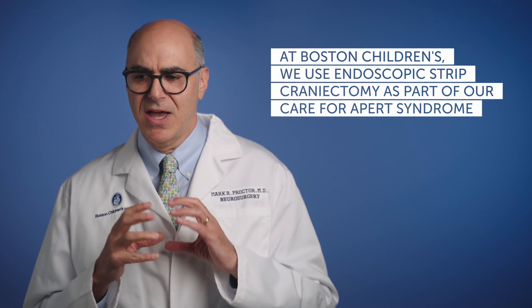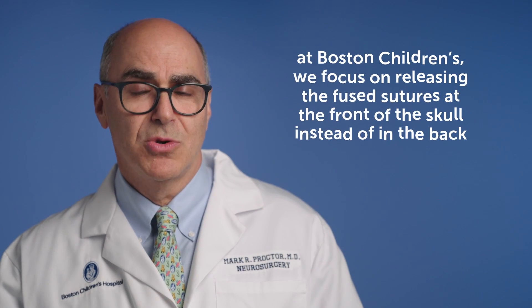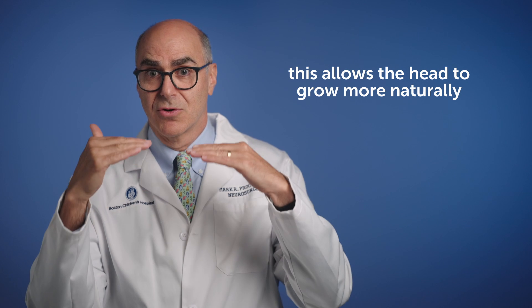Something relatively unique here at Boston Children's Hospital is that we've actually been able to use the endoscopic strip craniectomy for Apert syndrome. In Apert syndrome, you need an early operation to prevent the excessive growth and height of the head, which is a pretty difficult problem if not addressed early. A lot of centers do a big operation on the back of the skull — even though the fused sutures are not there — just to prevent the height. What we've been doing is releasing the fused coronal sutures, those are the ones up in the front of the head, doing that around three months of age, and then using a helmet to allow the length of the head to grow while avoiding the excessive height.